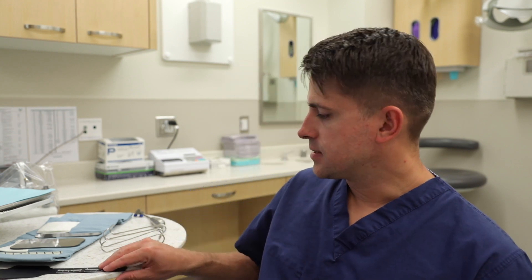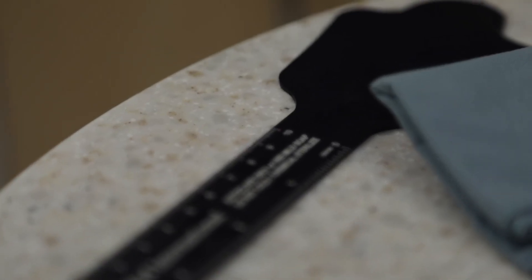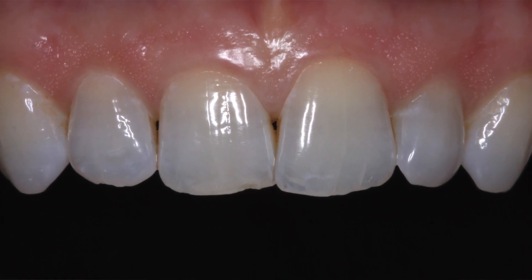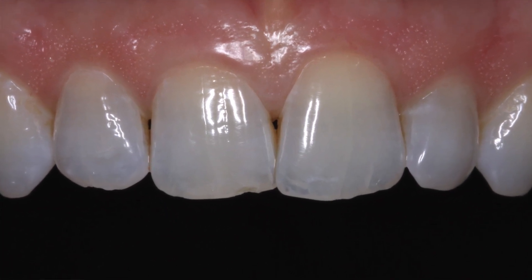Another thing you may want to get is something like this — it's a contraster. These are pretty cool because you can place this in the patient's mouth and it creates a nice black backdrop to really show and accent the teeth. It's great for documenting aesthetic cases or anything where you're going to have good before and after photos. It's relatively inexpensive but can make a huge difference in the quality of your photos if you're doing aesthetic dentistry.